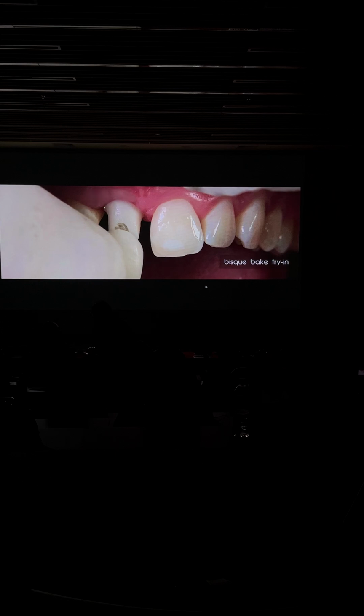In this case, I have the Rutten brothers from Belgium coming to San Sebastian because this case was going to be the first one that we were filming to show all the steps and basically how the European technician bakes the full contour bake, and then they try it. So I have my own lab at home. So we bake it. Every time you start removing things, the soft tissue loses its shape, which is normal.